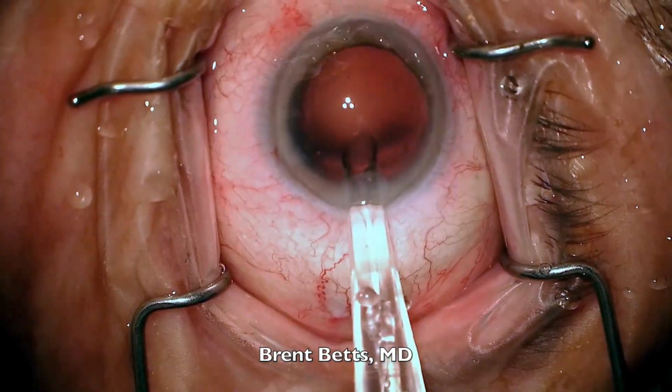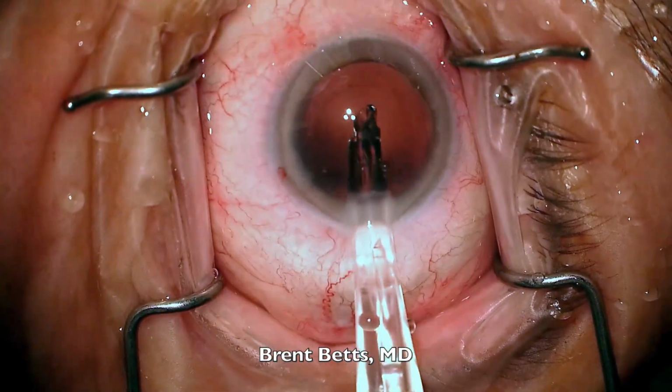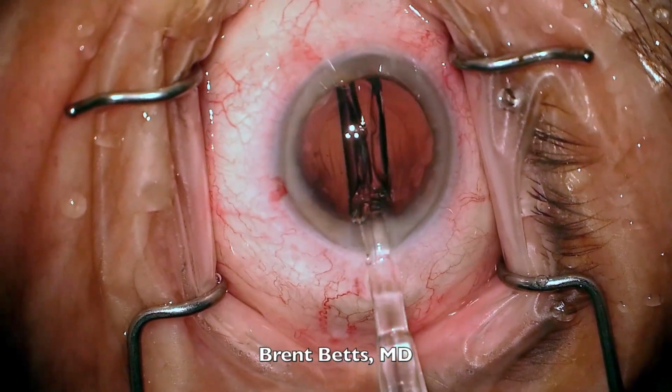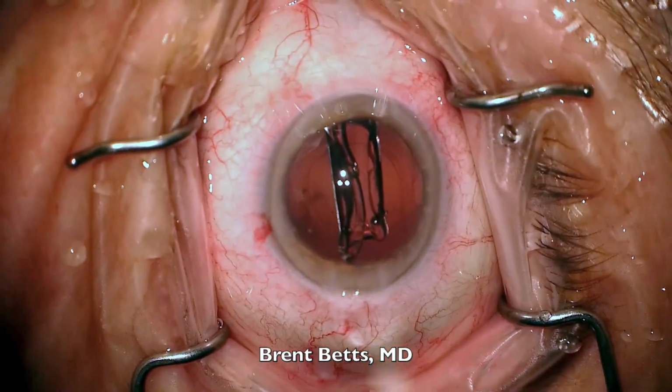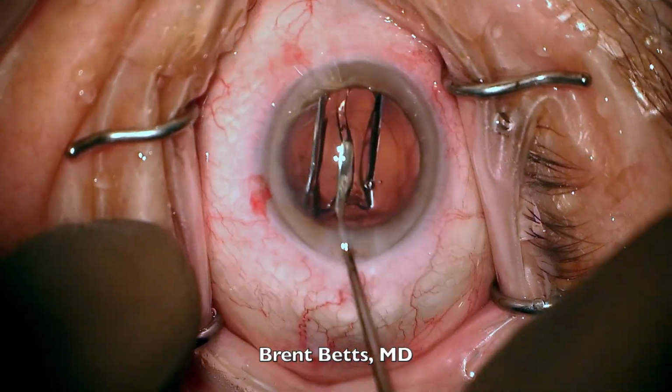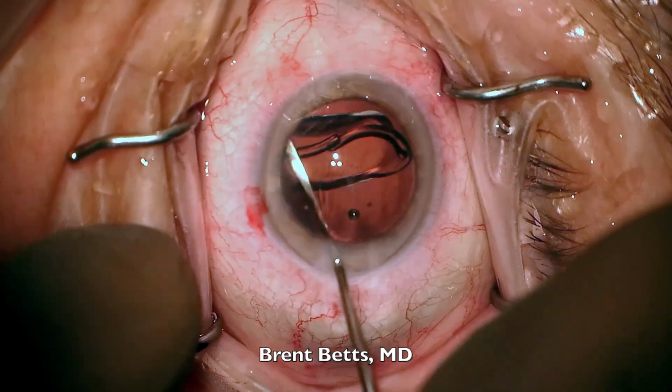The lens is preloaded into an injector, and I twist my hand to push it into the eye. It's kind of rolled up like a taco. The lens is made of a hydrophobic acrylic material. I'll position it with my Koch spatula.